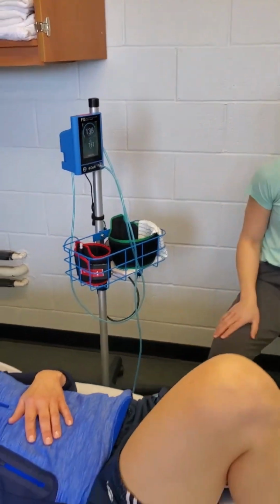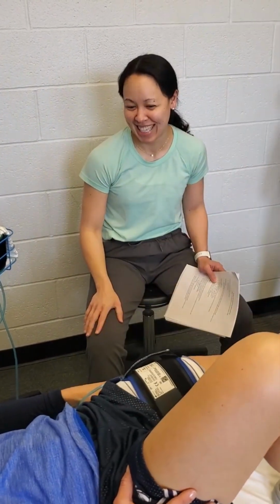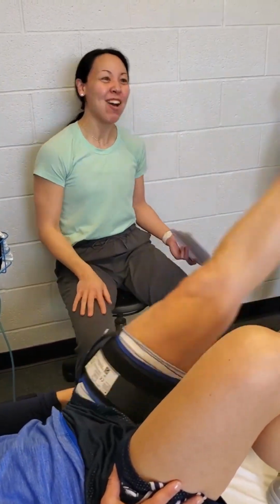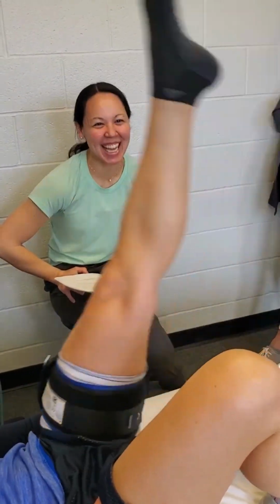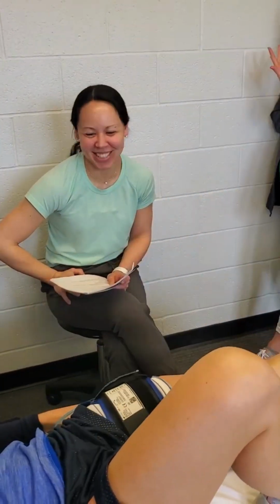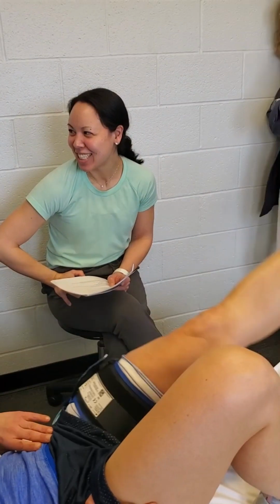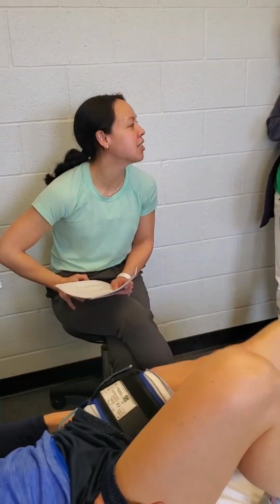And then you can start. Go ahead, Kendall, you want to do 30 reps. One, two, three, four. Look at your pointed toes. We're doing a little more proximal work in this case, correct?